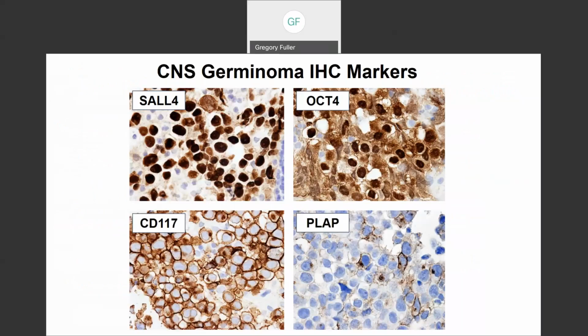Look at PLAP. Back in the days when I was a neuropath fellow at Duke, PLAP is all we had. It's all we had. This is a typical PLAP. Now, is this the PLAP that you see in Peter Berger's textbooks? No, you see every single cell beautifully positive. I'm not picking on Peter. He's my mentor, the most experienced, most knowledgeable surgical pathologist in the entire world. No, it's because you pick the 4-leaf clover, for the textbooks, not reality.